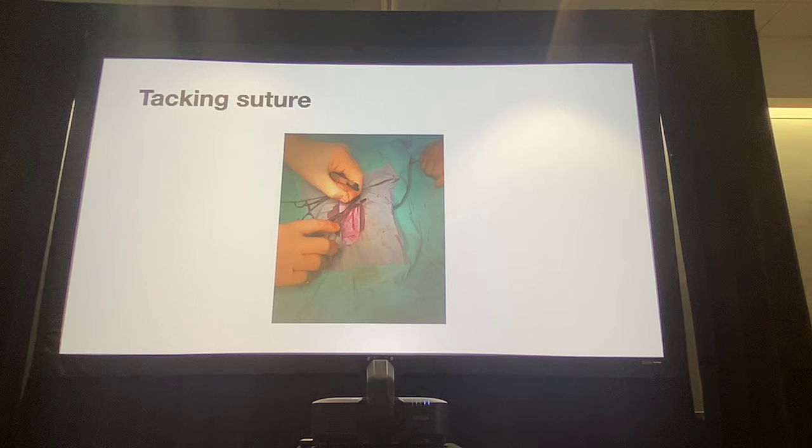And rarely I'll attach a omentum to the gastrotomy. It's hard to have a gastrotomy leak here. But if the stomach was of questionable viability, or you're worried about trauma from manipulation or whatever, then you can also attach an omentum there too, but it's fickle. Two or three interrupted sutures away from your incision, somewhere avascular in the organ.